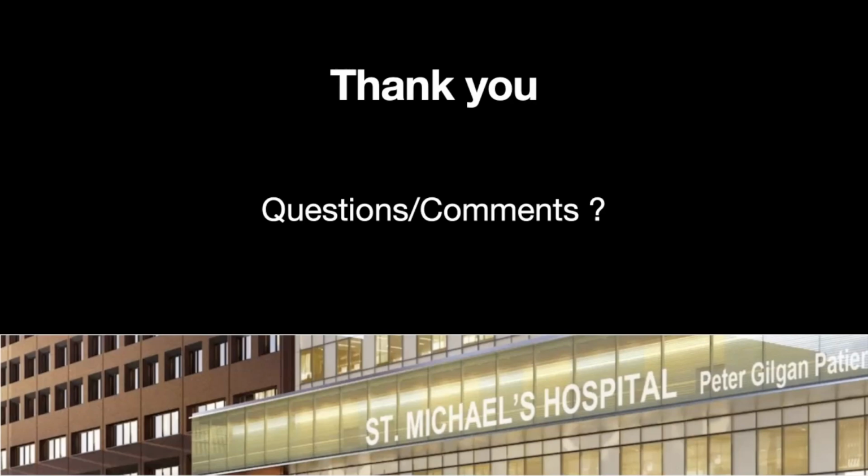Completely agree with those points about searching for that max velocity, which is why I found that beautiful illustration from 1985 so pertinent, because this is a long-standing issue that really involves a lot of work into trying to find that spot. And again, agree with the LVOT. I find myself retracing LVOT measurements over and over again to try to make it make sense compared to prior echoes. And finally, the point about CT calcium, as well as seeing that valve is quite calcified.